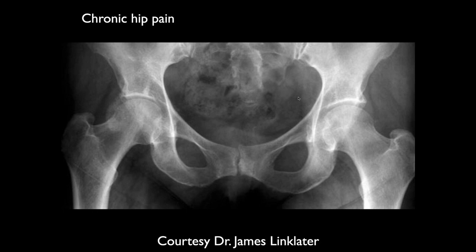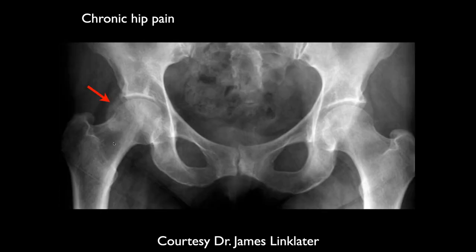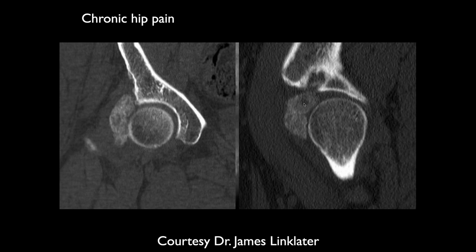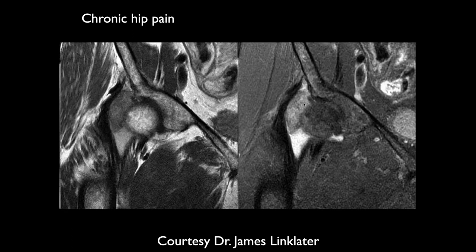Chronic hip pain. On the right hip, I see some kind of calcific density overlying the femoral head and neck that's protruding out. So it looks like it might be calcified along the joint capsule almost, because it looks like there's a little space here. And now we see this bony density right along the anterior aspect of the joint. It looks like some sort of heterotopic ossification or ossification of the ligament. It's actually bright on this fat-sat STIR imaging.